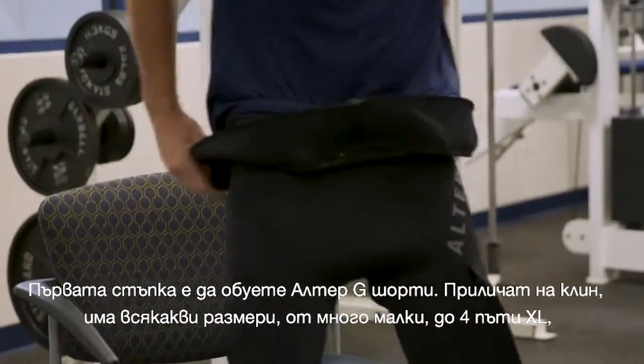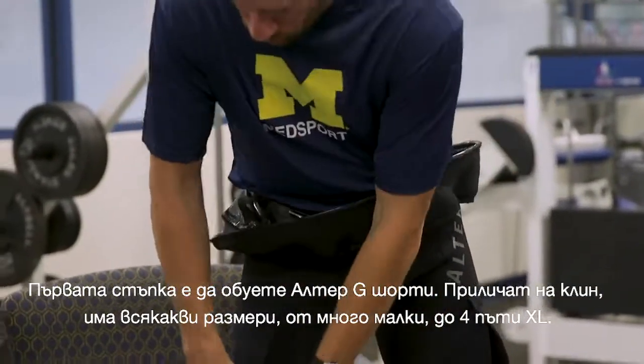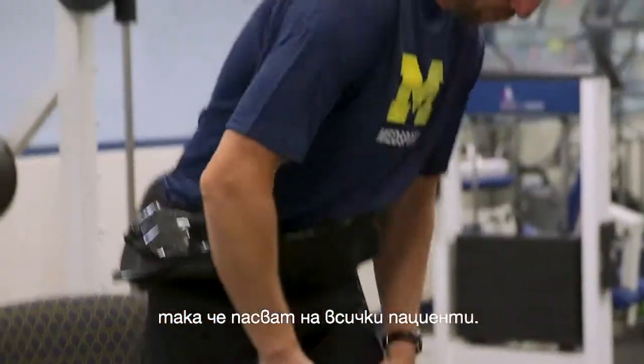The first step is going to have the patient put on the AlterG shorts, kind of like compression shorts. They come in multiple sizes all the way from extra small to 4XL, so they can fit basically any and all patients.